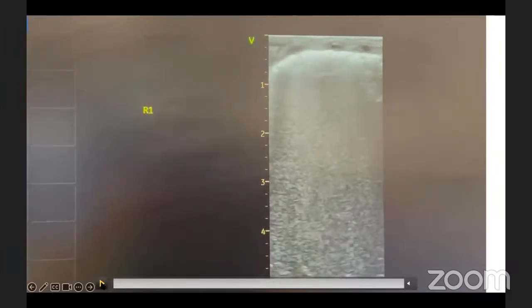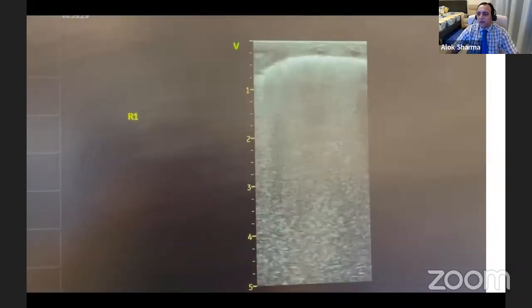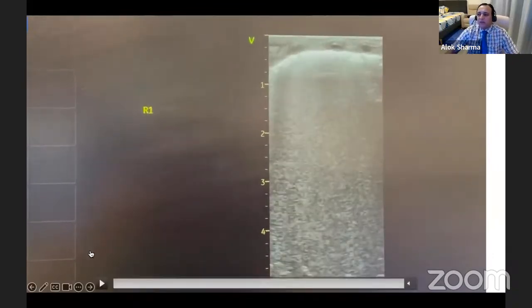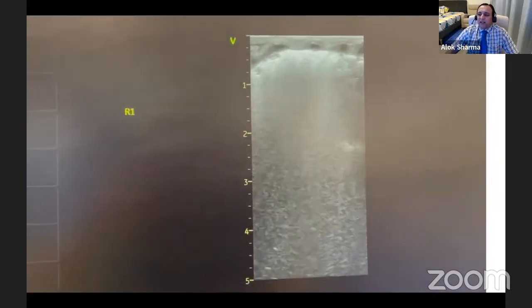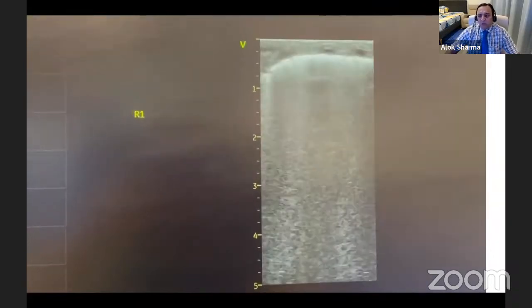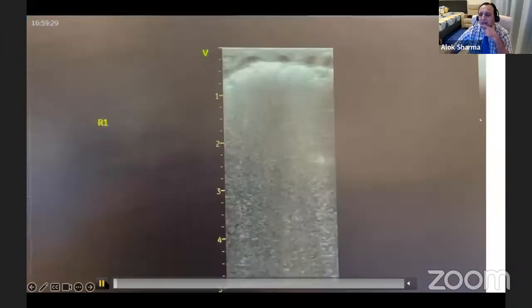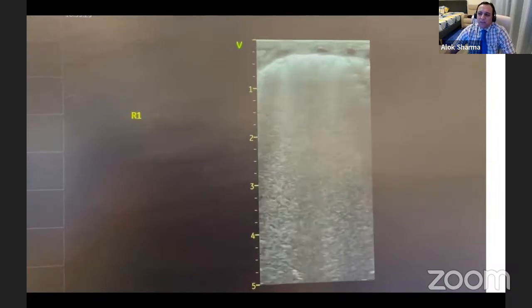Okay. Now, I'm just going to answer a few of the many questions we've got from the audience. Clearly, Doris's images have generated a lot of interest, which is what we really want. We want to learn from them, and I'm learning from them. R3 asked about a double lung point in the first image. I don't think so. My gut feeling is that what you've basically got is a differential clinical picture of different areas merging, so I'd prefer not to use the double lung point terminology.